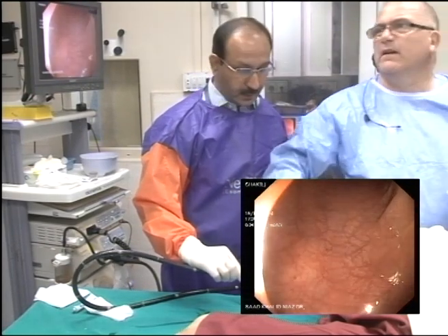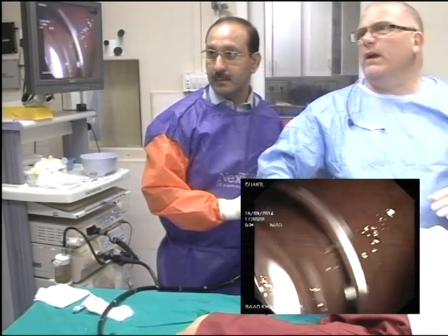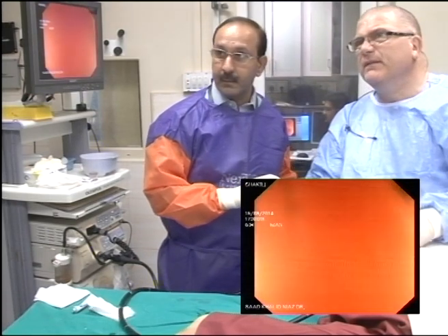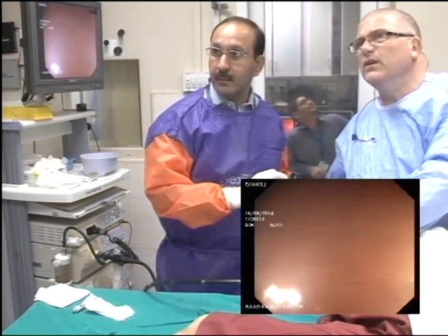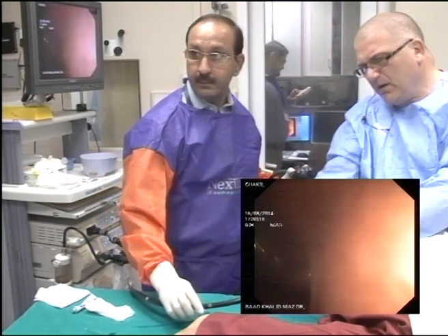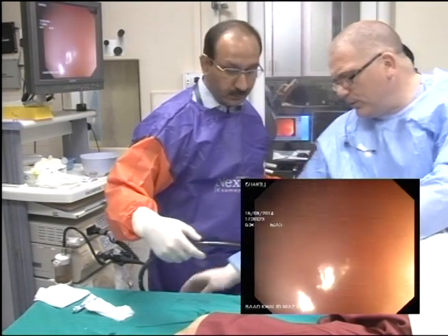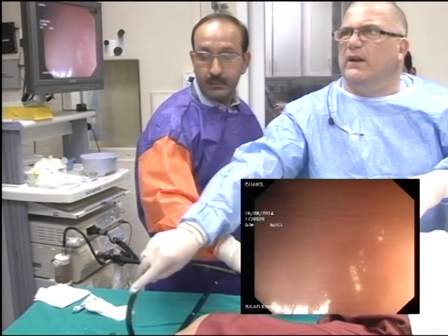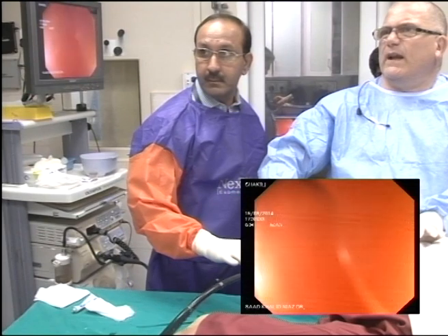Brilliant. Right. So we're there. Big wheel forward. Yeah? Now, big wheel all the way back. No, back. Back. Good man. Little wheel back. Good. Advance. There. No, no, no. Keep there. See it? Don't force the scope. I'll show you in a moment what you've been doing. So here, and then draw the scope, and now let it come round.